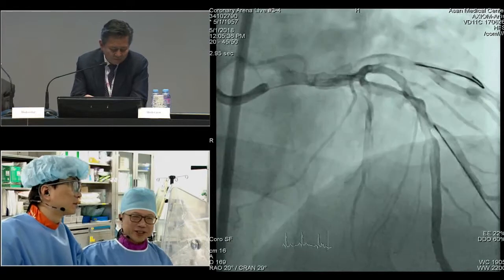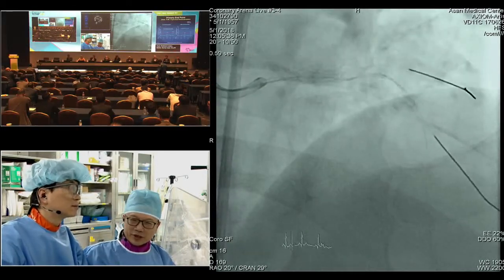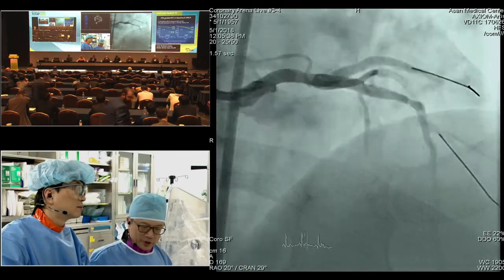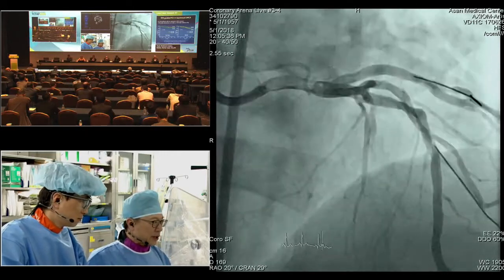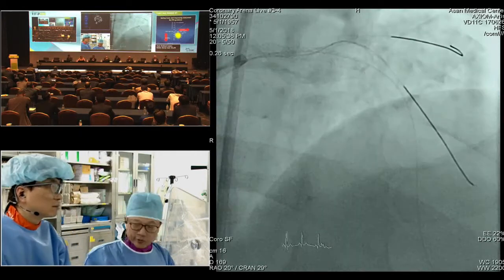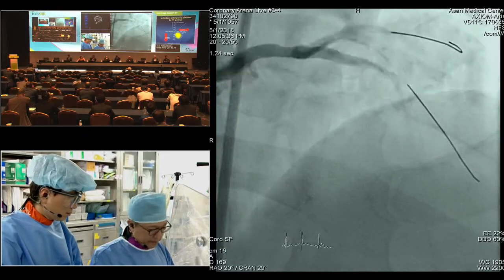Absolutely. I like the stent to be natural, covering the most important part of the vessel. And the side branch on the 3.5, once you open it up, is a pretty good hole. So there's no need to distort the stent. We can use a 4.0 to open up, but at this time I would probably remove the wires from the side branches because they're in our way.